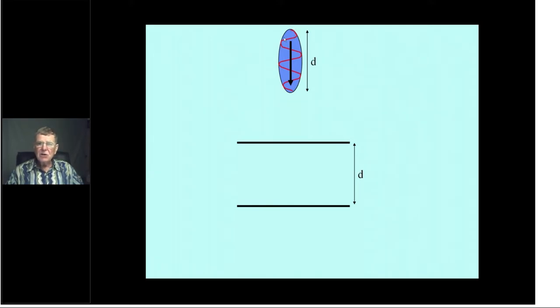It depends on, firstly, how many cycles there are and how far apart each cycle is. In other words, the wavelength. So it's got a certain depth, a certain distance. Now I'm going to show that pulse coming down and striking 2 interfaces within a patient. At the moment, I've put the interfaces the same distance apart, whatever that is. If it's a 2 millimeters spatial pulse length, at the moment I've set the interfaces at 2 millimeters apart.